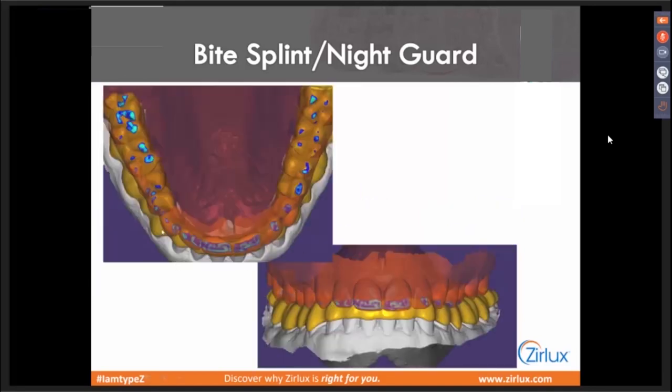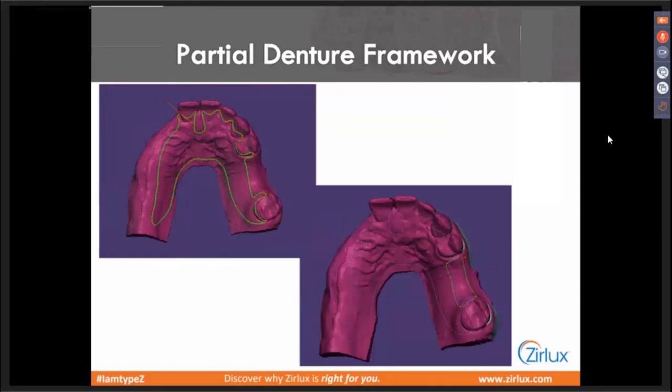Here's our bite splint. Everything else from there is the same. That's why when people are thinking about getting involved with the Xurlux Acetal, bite splints are a nice one to start with — because you're not doing anything different if you're familiar with doing bite splints in PMMA. Do everything the same. Even when you load it into your CAM software and choose your milling strategies, it's all the same as PMMA — same burrs, same tools. That's a good option to try on your first go with the Xurlux Acetal.